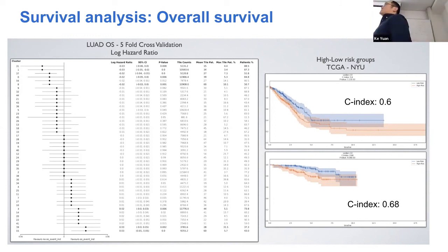I think the major risk for us is identifying clusters that are too patient specific, right? Then you lose the predictive power carrying through in the entire cohort. But I think you want some patient specificity in those clusters. That's why we listed the number of patients contributing to those clusters, and also the number of tiles.